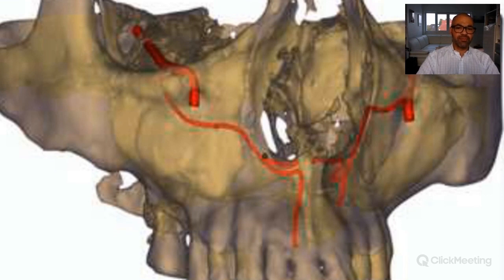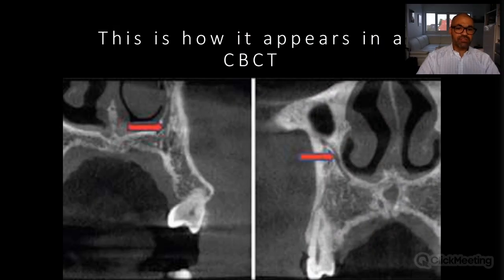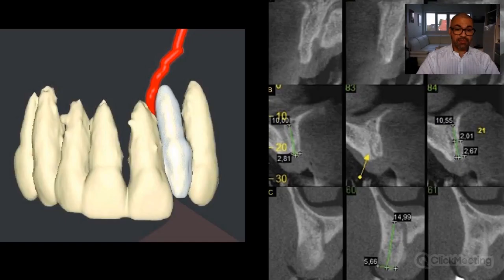This is the structure that I address when you have pain issues, or sometimes unknown pain issues, in patients where you place an immediate implant or a delayed implant. And it's important to know that this structure is obvious in many of our patients. So it is something that we need to understand and to identify prior to the implant placement.